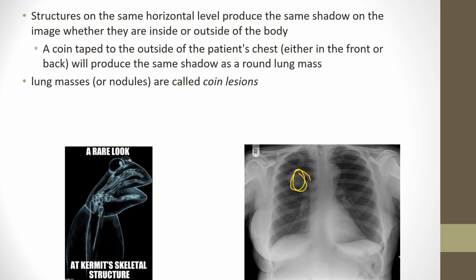There was an X-ray at a conference, and the doctor pulled it up. He's like, tell me what you see. And there were just nails, like from a nail gun, all over this person's thorax, and he's like, what's going on here? And he's like, nothing with their lungs. This was all in their clothes, because I guess they fell down at a construction site, and there were all these nails and screws and stuff all over the place, just in the clothes and jacket and all that stuff. So it was pretty interesting. So just be aware, some of the stuff could be on their clothes too, and that's why you might see some things that are unique here and there. Just keep in the back of your mind that it could be something other than what's inside their body. It could be outside their body.